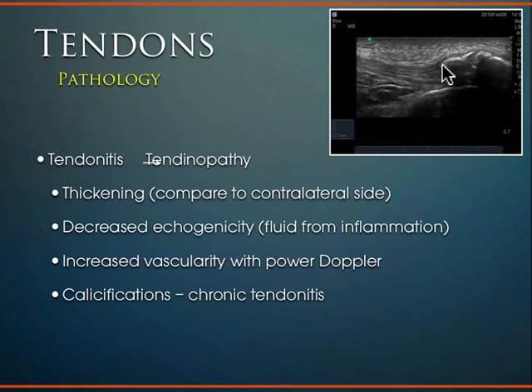Just like bone, the calcific changes that you can see on this image here tend to be very thick, hyperechoic structures. So these are calcific changes within the tendon architecture through here. And just like bone, you're going to get a lot of deep shadowing below that very hyperechoic thick tissue because the sound waves don't penetrate through.